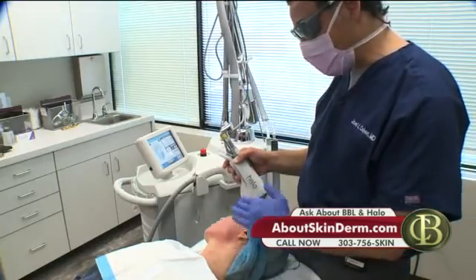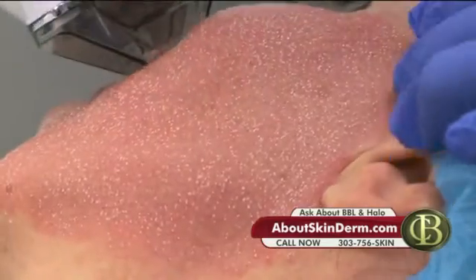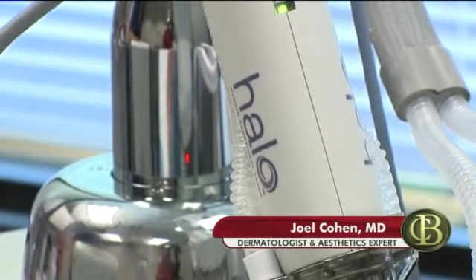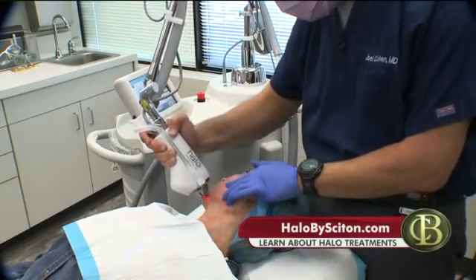Most people classify Halo as something that's not all that painful, and we'll see during the course of our treatment with Lisa today, I think most people say it's somewhere between a 2 and a 3 out of 10. Some people may say 4. The thing about Halo is it integrates a cooling device, a device called Zimmer, so we could actually use that cooling device, and it's connected to the handpiece, and we can turn that up. So these are things where we use topical anesthetics. So right now she has a topical anesthetic on that's meant to help a little bit, and then with the use of the Zimmer, it can be really helpful just to decrease some of that heat that she'll be feeling over the course of the treatment.